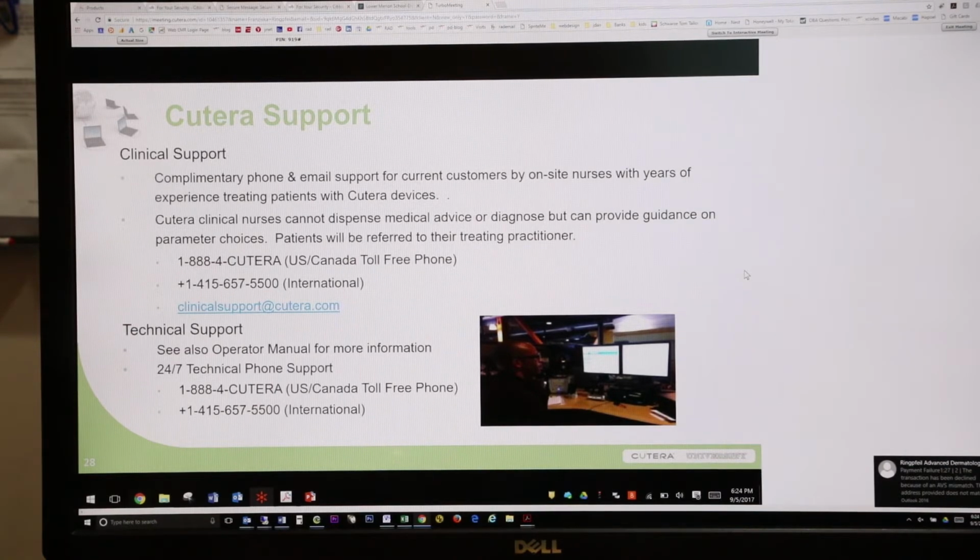Colors? Yes. Oh, multicolor tattoos. Yeah, for example. Okay. Sure. So, like I said, we always start with 1064. We remove the darker components of the ink first, which is, if you remember the slide, the majority of your tattoo inks contain a black component. So that's a significant part of the tattoo that you can remove.